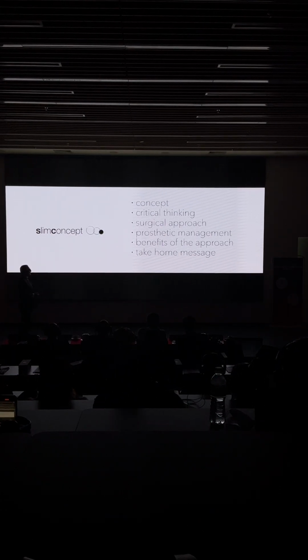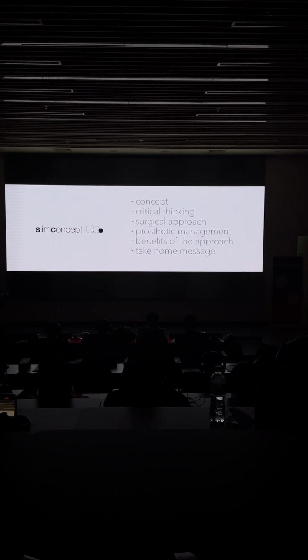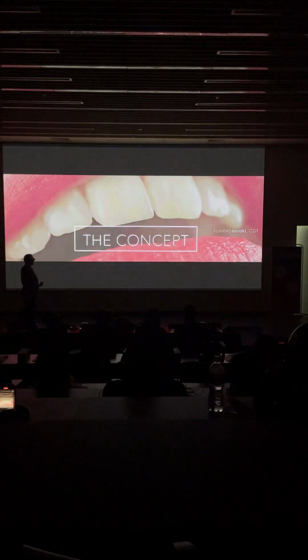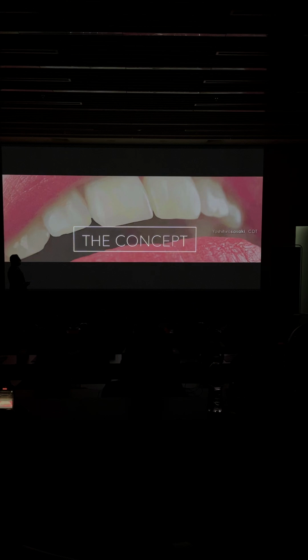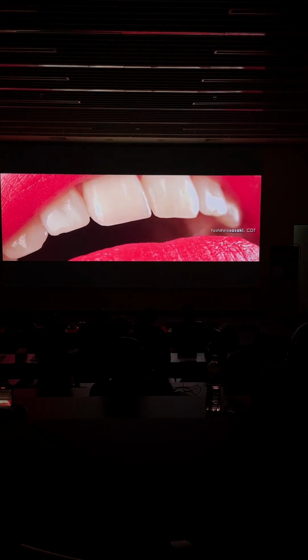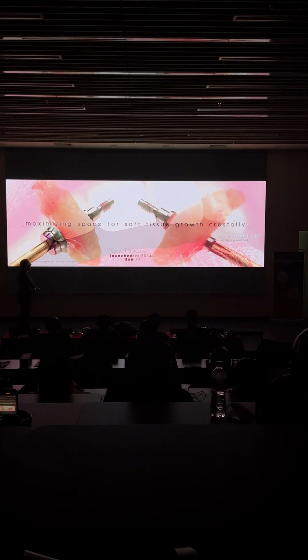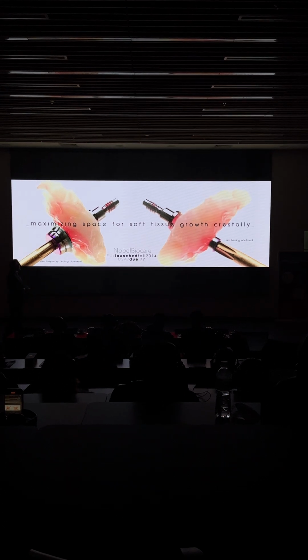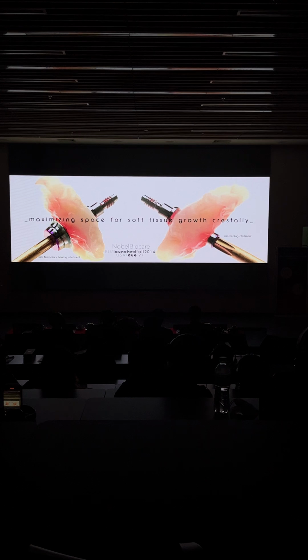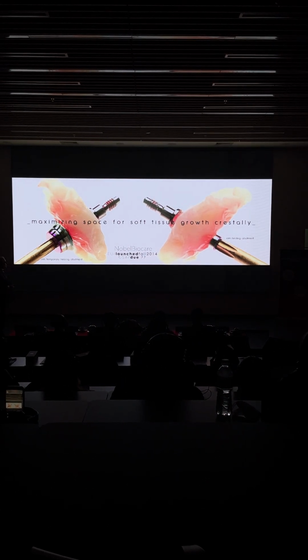Let me discuss the critical thinking, the surgical approach, and the prosthetic management, the benefits, and the take-home message. The concept is rather easy, is misunderstood, is underestimated, and basically is grafting crestally where the prosthodontist needs it the most, and it's just grafting with patients' own tissue only.